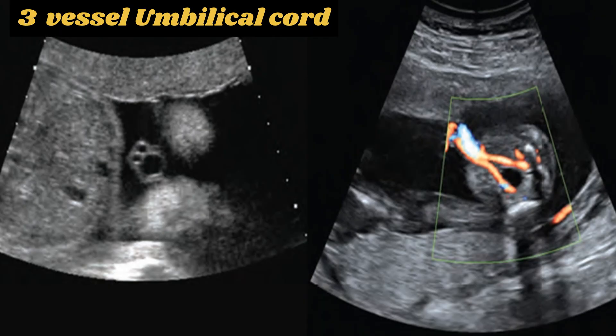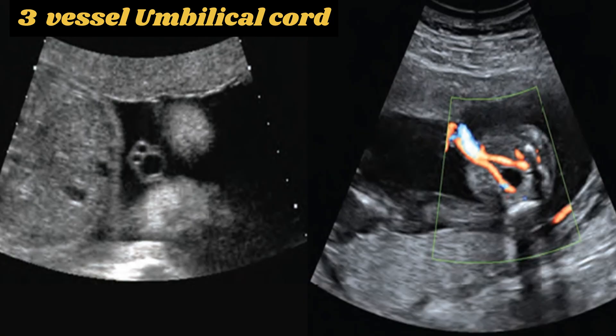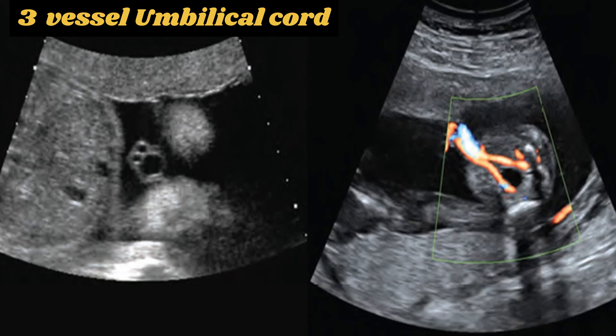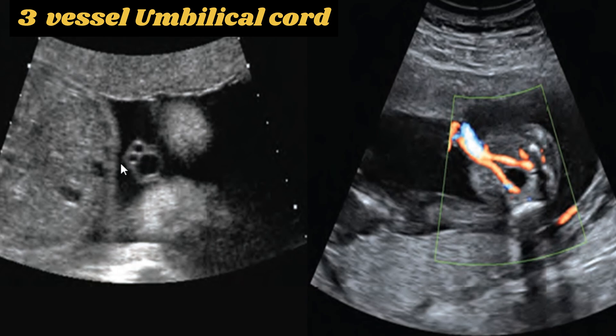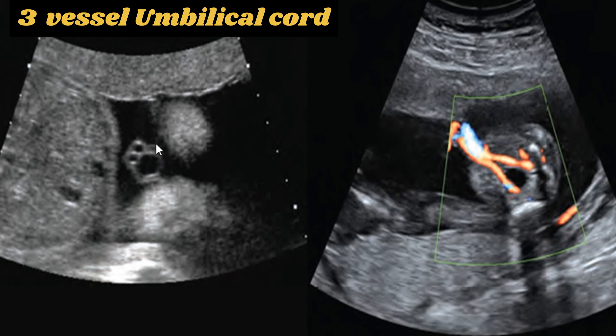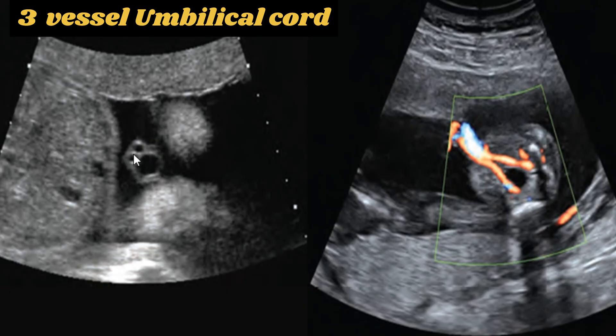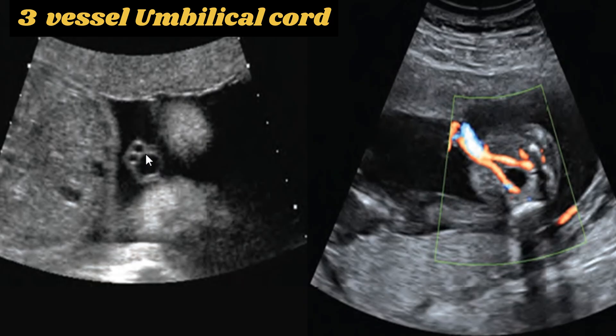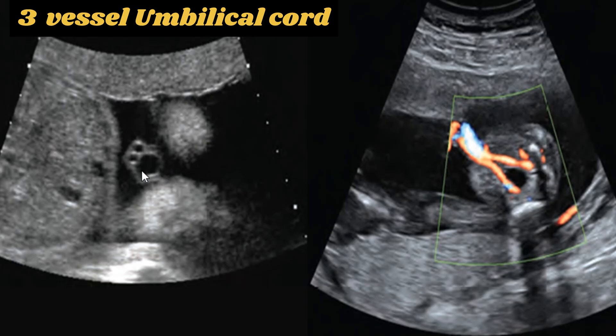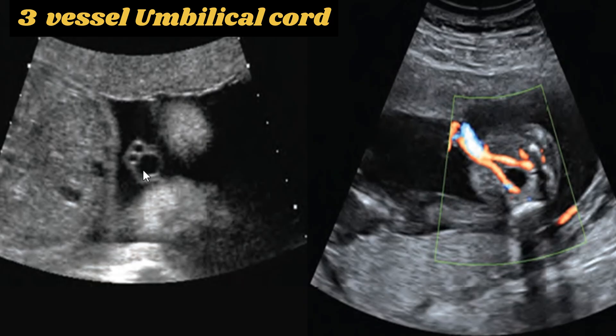Now we are going to discuss the umbilical cord and its vessels. The normal umbilical cord contains two arteries and one vein. The number of vessels is determined by counting the blood vessels in two cross-sections of the cord. In this sonogram, the cross-section of the normal three-vessel cord shows two arteries with a narrow lumen and one vein with a larger diameter than the arteries.